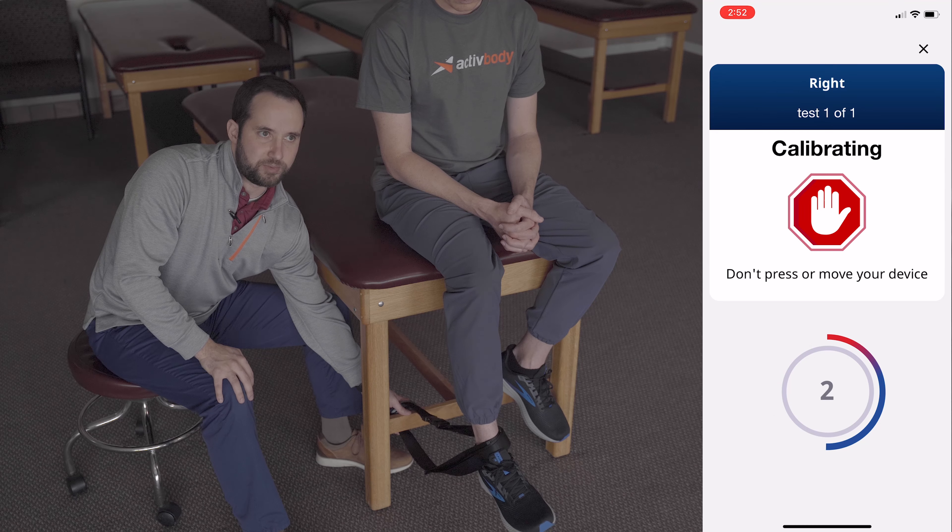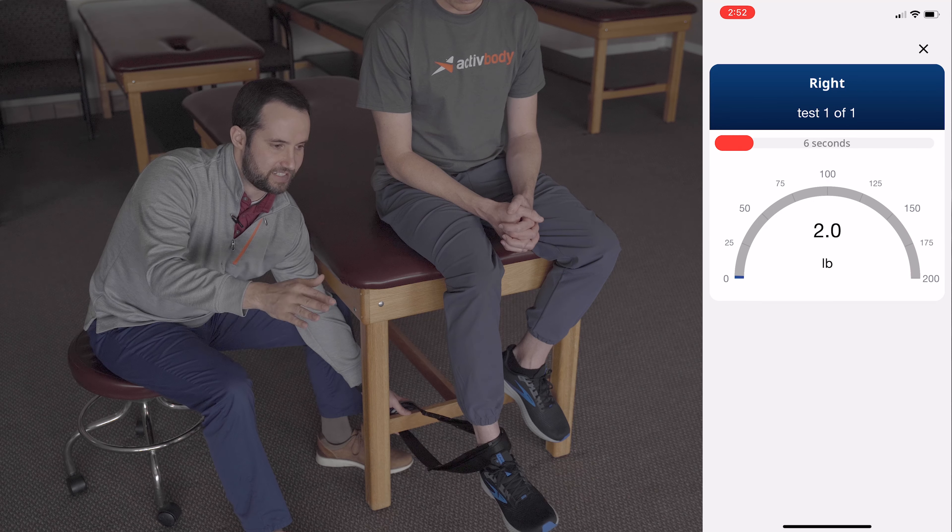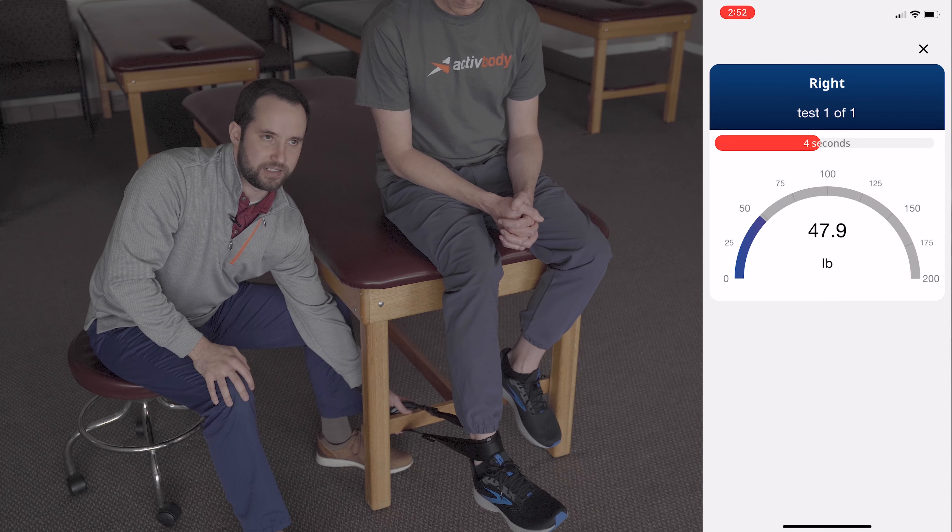You're then going to hit start on the device and wait for the device to calibrate in this position. Once the device is calibrated, you're going to instruct your patient to extend their knee as hard as they can against the belt loop.